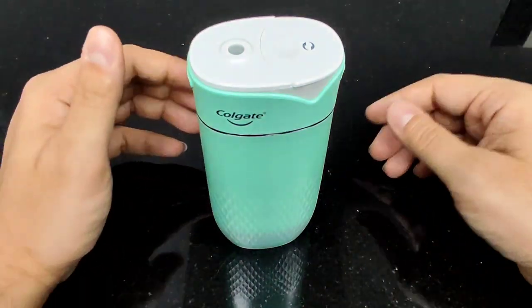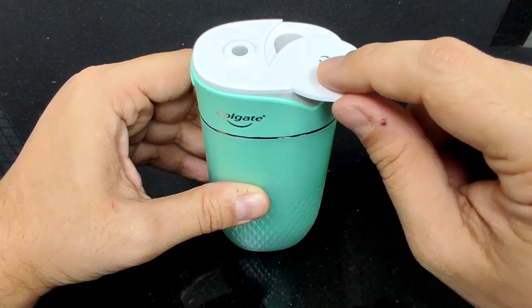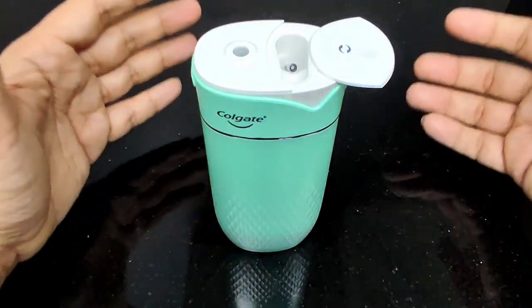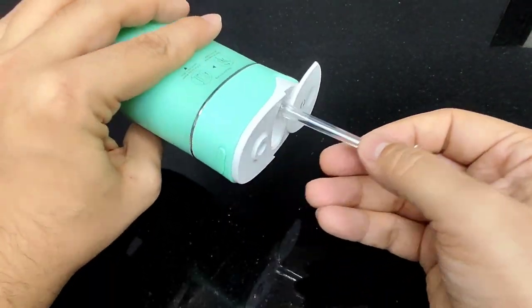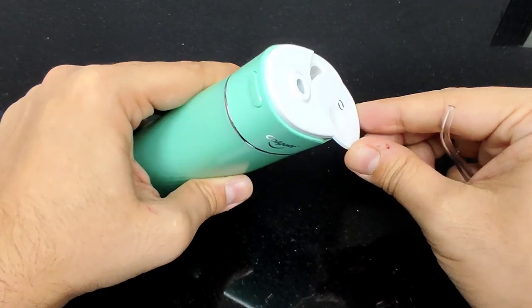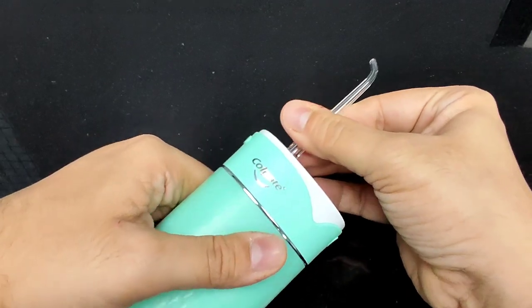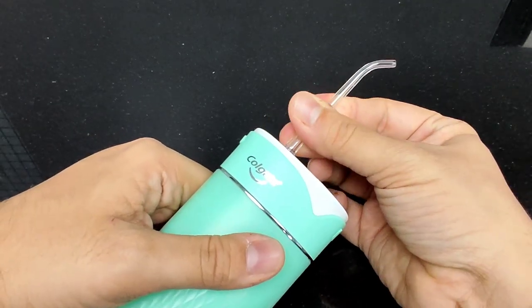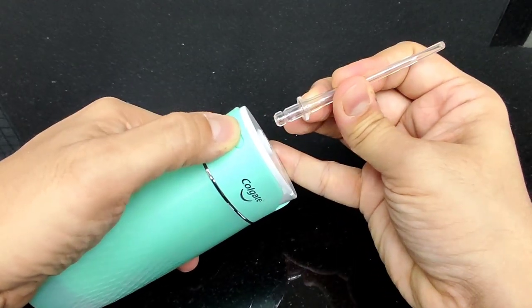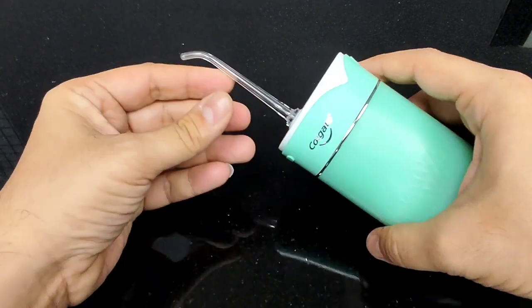Now for the reveal of the secret — there is a hidden compartment here. Inside you'll find the delivery tip stored away. Patients often tell us these tips break, and Colgate has come up with an absolutely ingenious solution. I can clip the tip on and use it as needed; it rotates a full 360 degrees. There's a button that allows me to release it without breaking it — very convenient design.